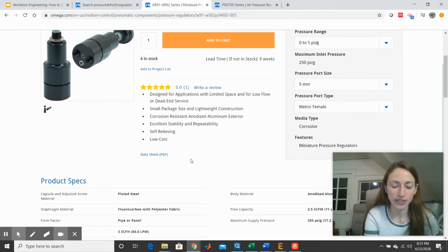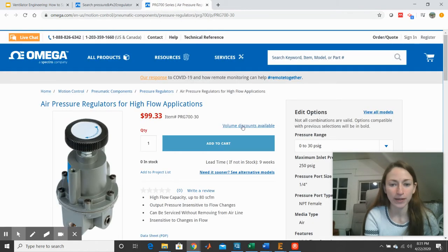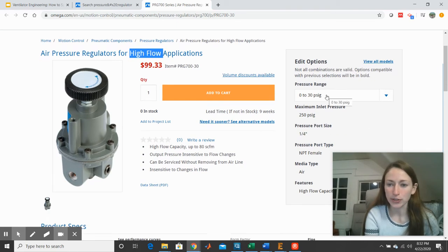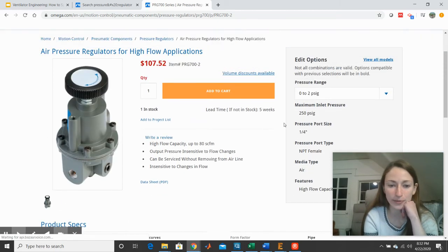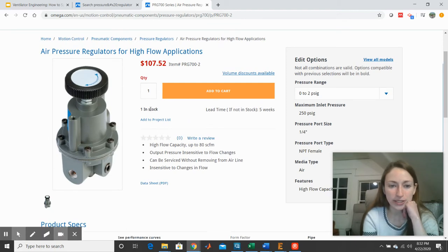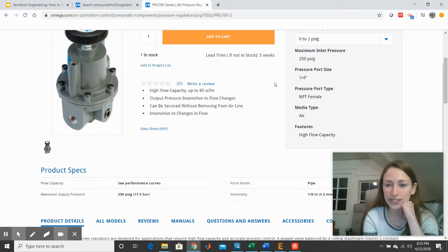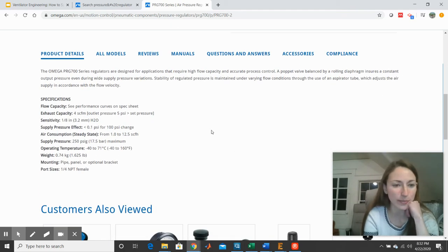We could look into the data sheet to see if there's any additional information, but for now, I'm gonna nix this one. Let's compare the air pressure regulator that was specifically designed for high flow applications as well. So again, I'm gonna set the pressure range down to the one that fits our specs a little better. And indeed, this one is in stock, so that's good. And immediately I noticed that it fits my fitting qualifications. It's 1/4 inch NPT, so that's something that I'll be grateful for if this part works out.